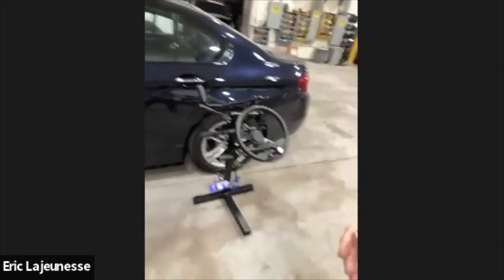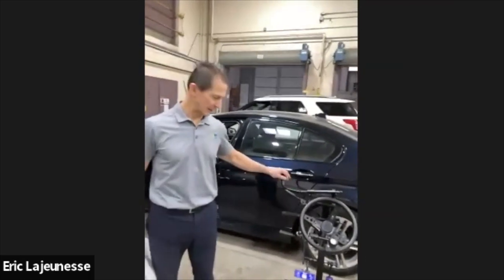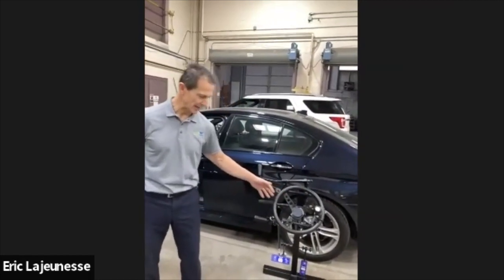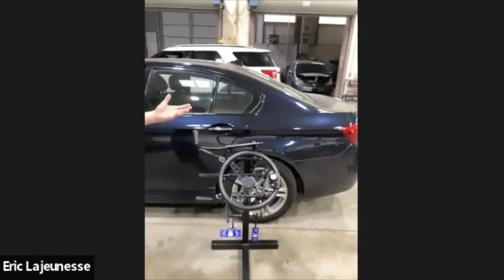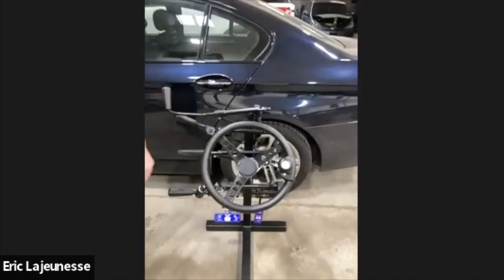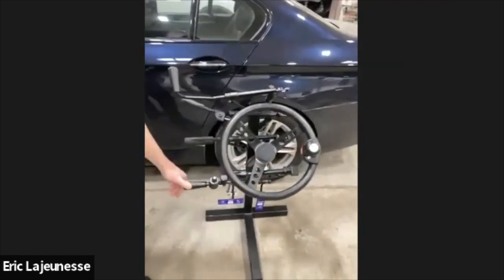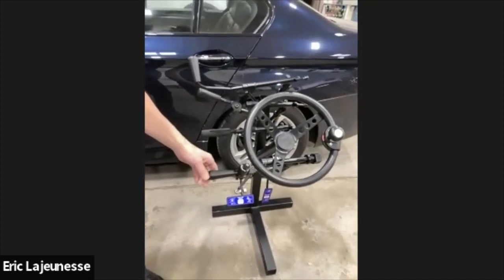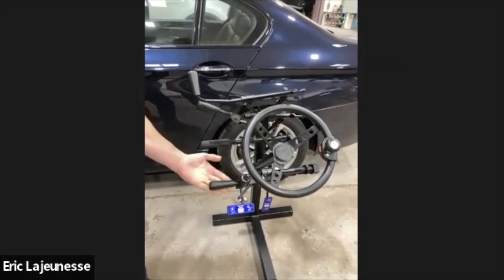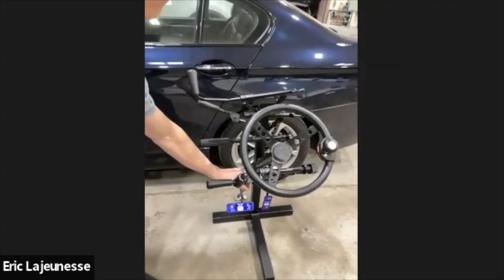Alrighty. So when I do the in-services at Spalding, I usually bring a hand control demo stand. Basically, the hand controls are pretty simple. They get mounted to the steering column. You can operate the brake by one push of the lever, and in this certain device, you pull forward for the gas. So this is called a push-pull type of hand control.